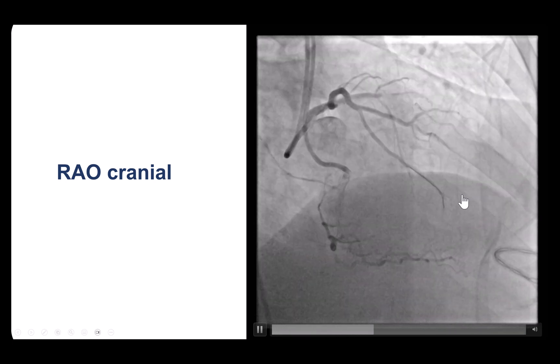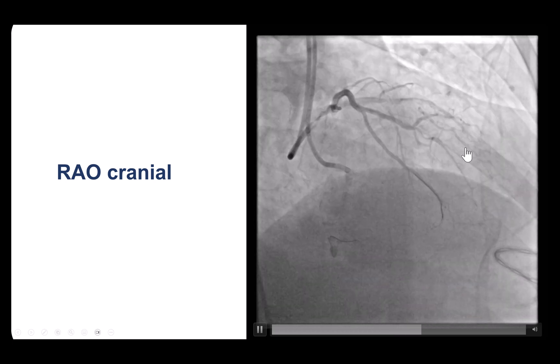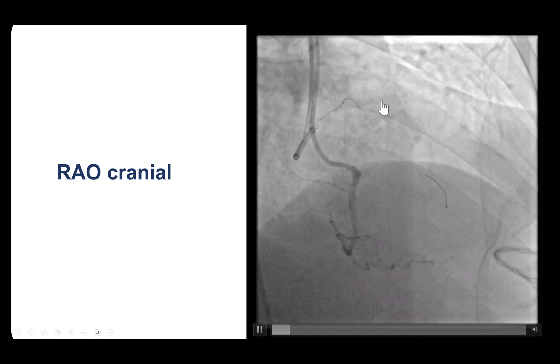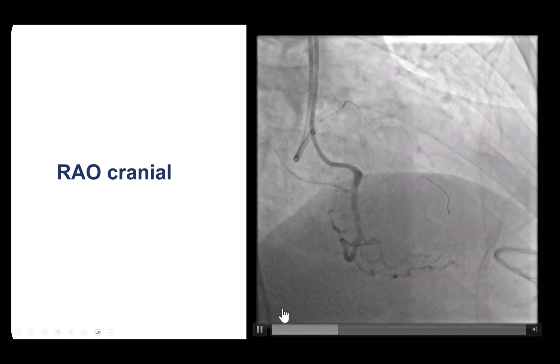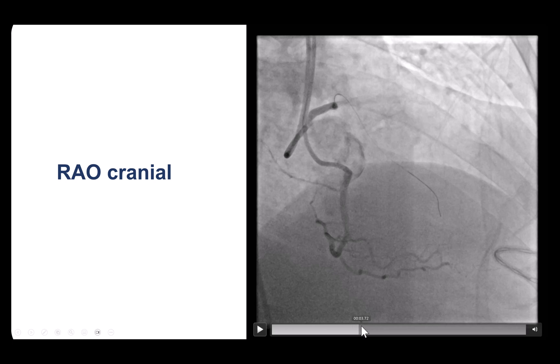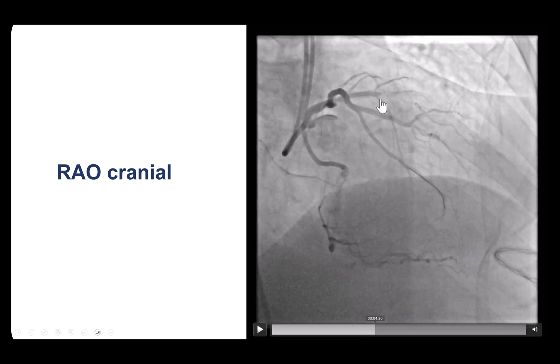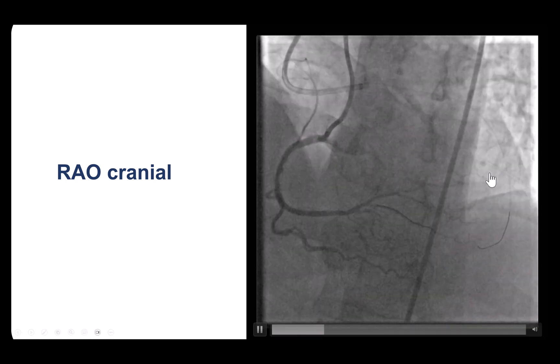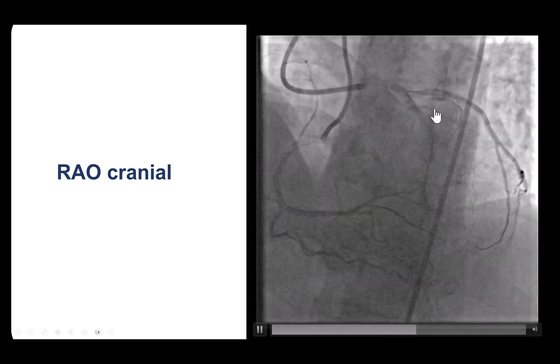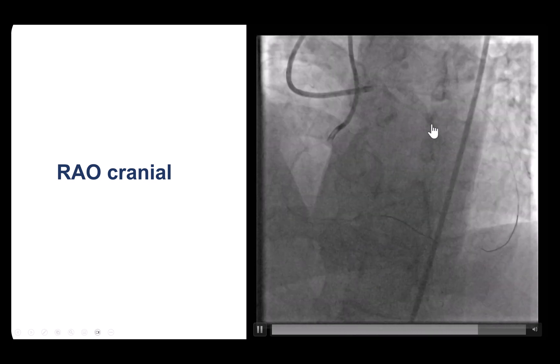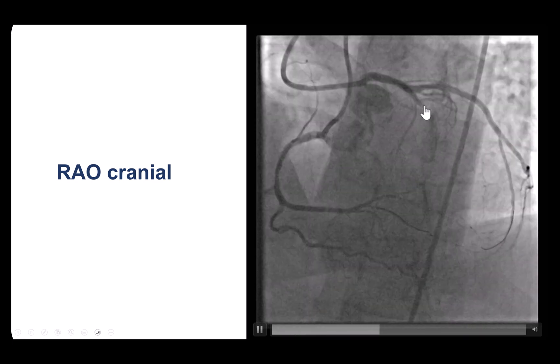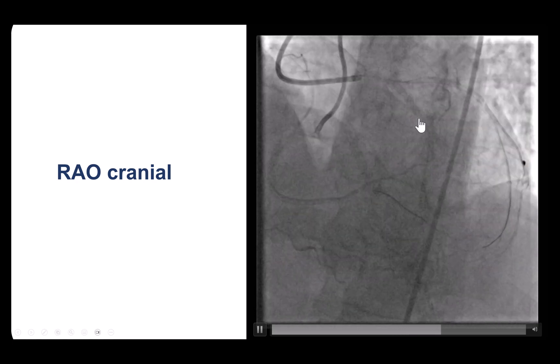We can see some septal collaterals going all the way to the LAD. The LAD has a well-defined proximal cap — it is a tapered cap, but there is significant calcification, short lesion length, and the distal vessel seems to be good quality. The same thing can be seen on the LAO cranial, where we see the short occlusion length, some bridging collaterals, and some septal collaterals. The distal vessel is good quality, but there is heavy calcification on the proximal cap.